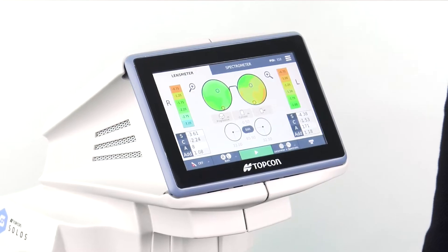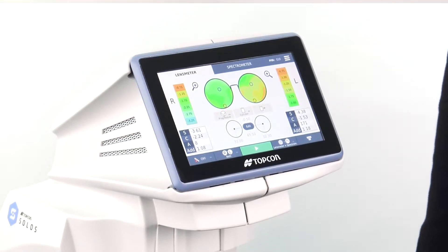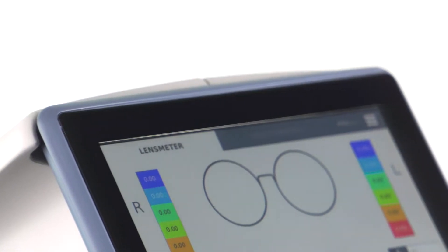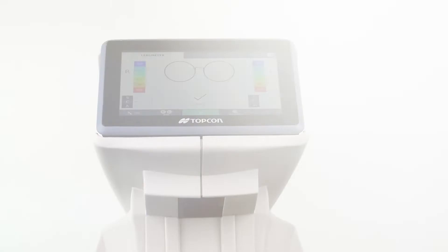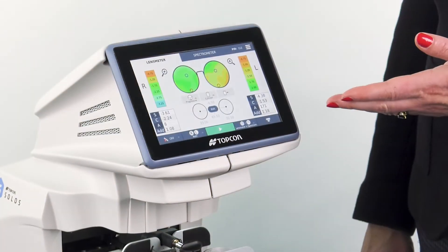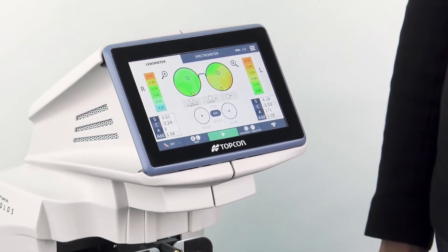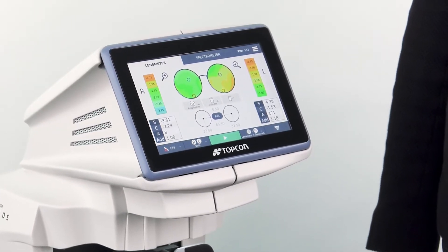Hello, I'm Catherine and I'm going to show you how to review the data captured with the Solos automated lens analyzer for a progressive lens. Here on the screen you can see all the mapping information captured by the Solos with a touch of a single button.